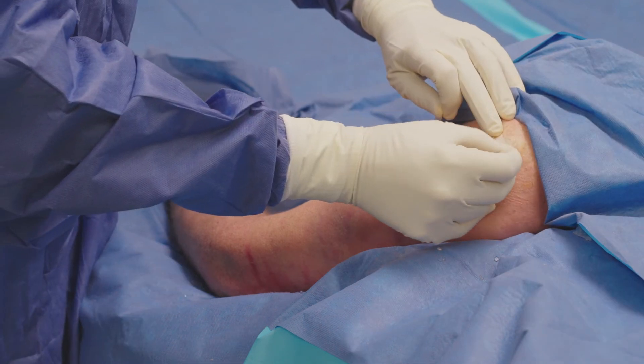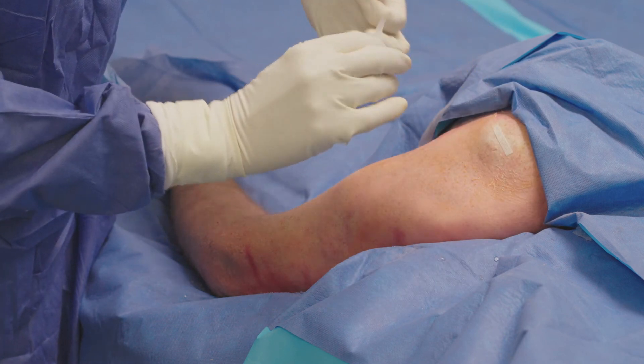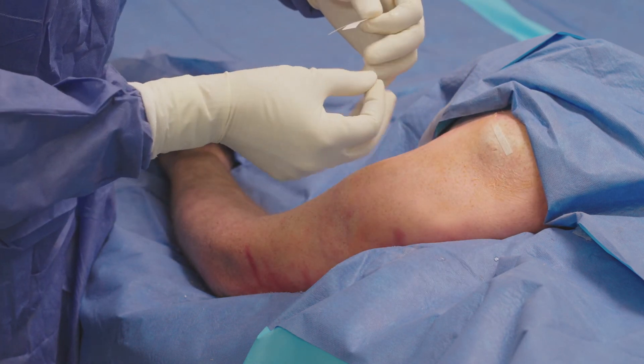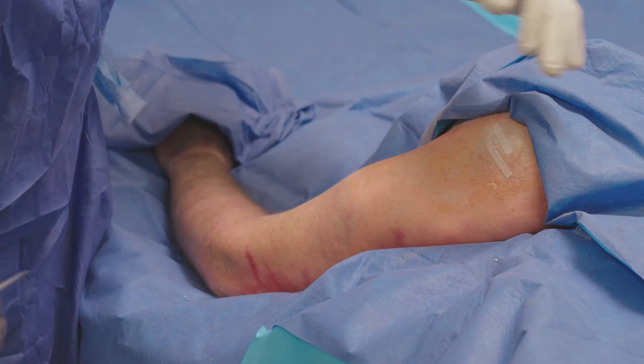Since the procedure is performed through a stab incision, there is no need for sutures. I place Steri-Strips and a small gauze bandage over the incision, which is then covered with a Tegaderm. Using TenJet is a very efficient way to debride chronic tendon pain. It utilizes the high velocity water jet to remove the diseased tissue and restore function.